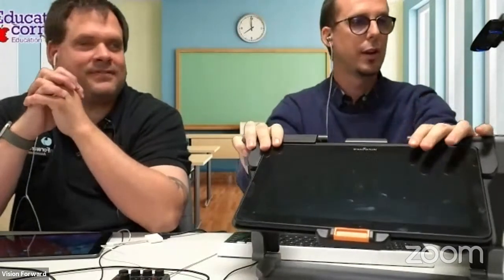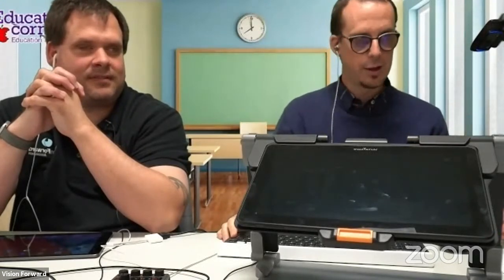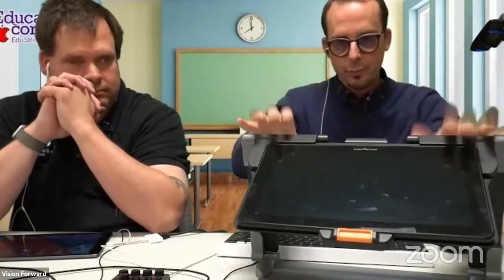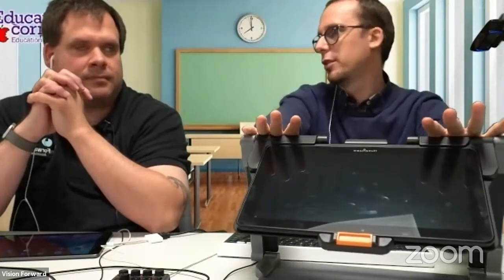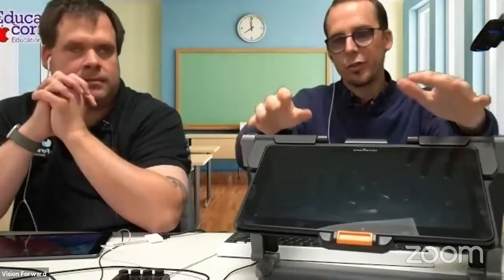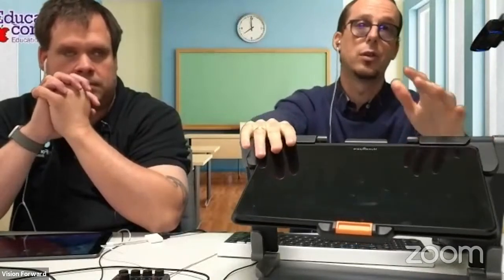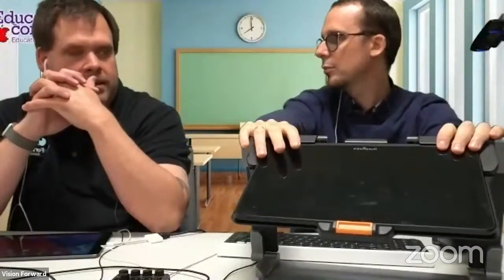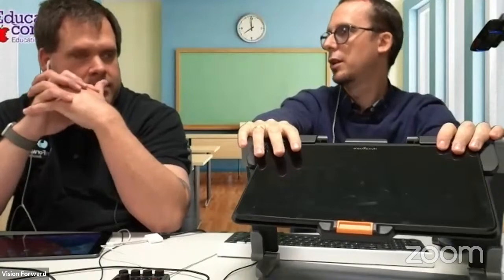And this is the Connect 12. So this is a device made by Humanware, made specifically for the education market, although it can be used outside of that, but it has a number of features that make it very applicable to the education market. This is quite a high-tech device. When we talk about high-tech devices, there's some stratification. The magnifier we just looked at was very simple to use, just a few buttons. But something like this that we're going to look at now, we're talking about going up a level in terms of complexity. So depending on the student and their comfort with technology, this might not be applicable. And you'll see that this device offers way more. Obviously, the more functionality it offers, the more complexity it's going to have. Exactly, yeah.